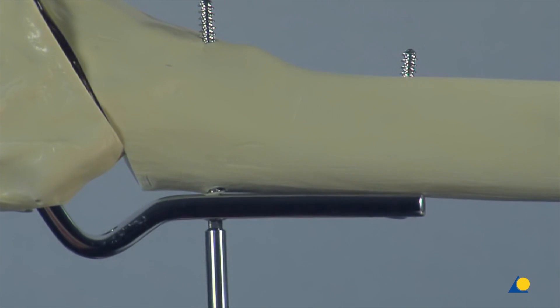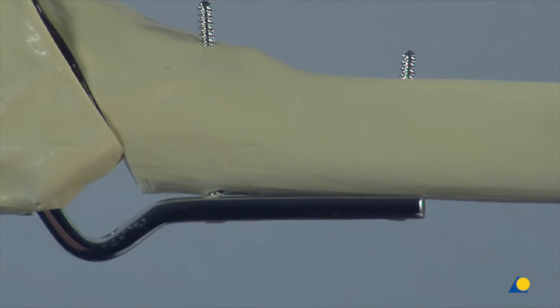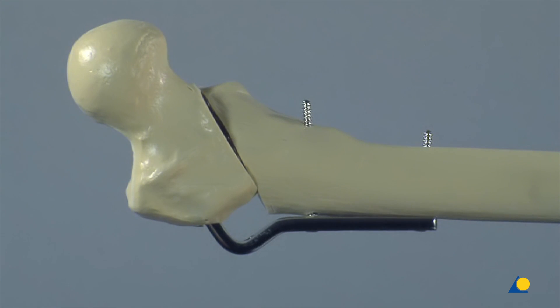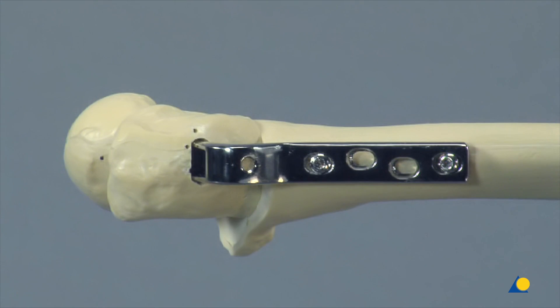The tightness of the proximal screw is checked. The completed osteotomy shows the successful correction of the proximal femur.